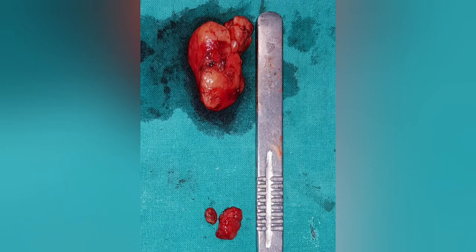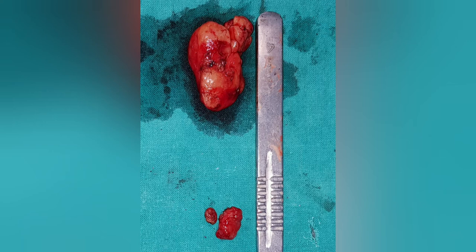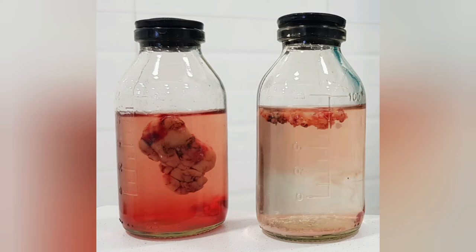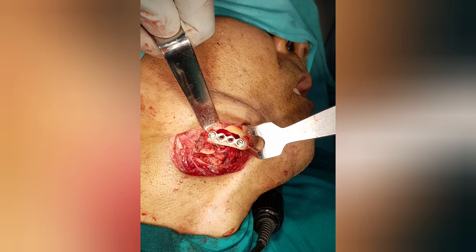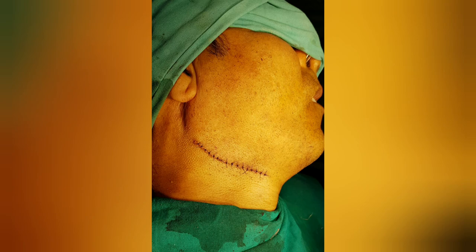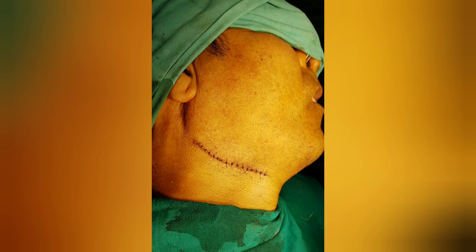This is the specimen along with the Level 1b lymph node, which was a large node, and the primary pathology — the specimen has been collected. These are two jars: one for the Level 1b node and one for the primary lesion. After this, to maintain mandibular strength, I placed a reconstruction plate over the inferior border of the mandible. Final closure has been done in layers to achieve proper functioning as well as cosmetic appearance of the patient. This was an interesting case and we have finished it nicely. Thank you very much.